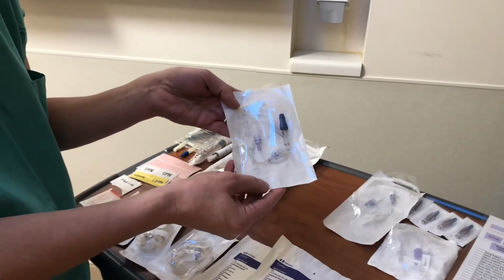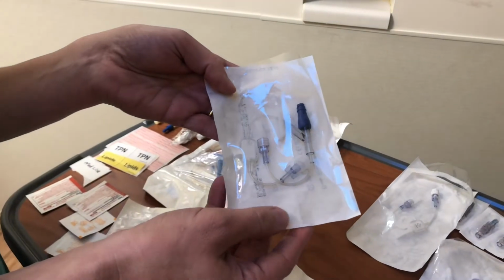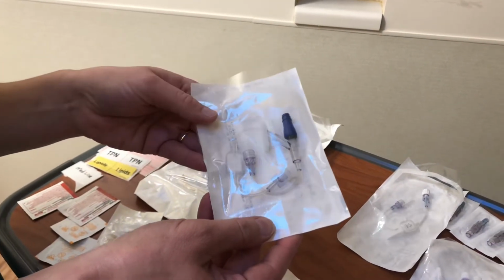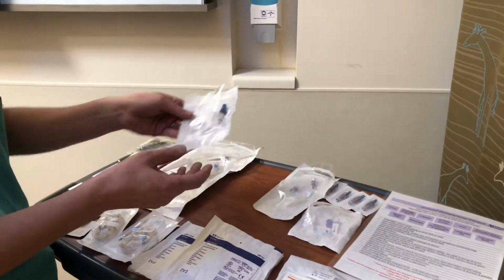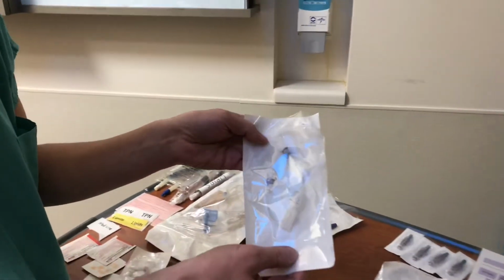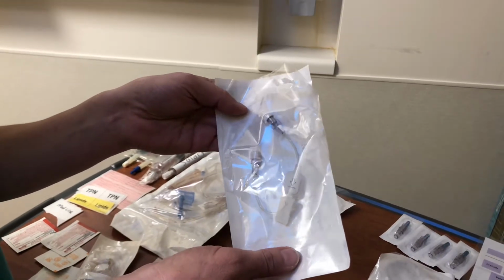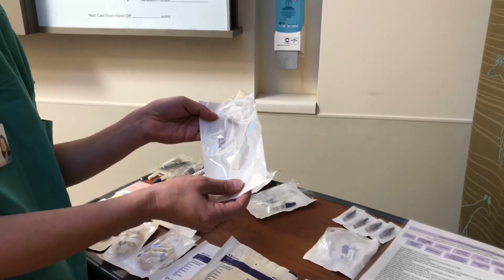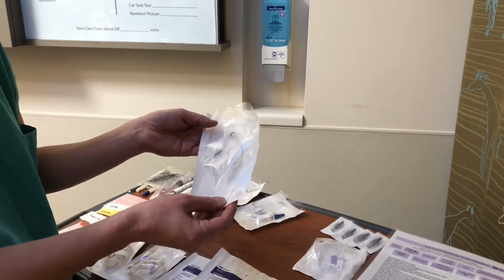So the first one I'm showing here is our IV or TPN filter. And again, you notice this one because it has the blue clave. And it's also the smaller micron, the 0.2 micron. A lipid filter. Again, the lipid filter does not have the blue clave, and it's a bigger micron, a 1.2 micron. And if you think of it as lipids being thicker and fatter, they need that bigger micron to be able to move through the filter.